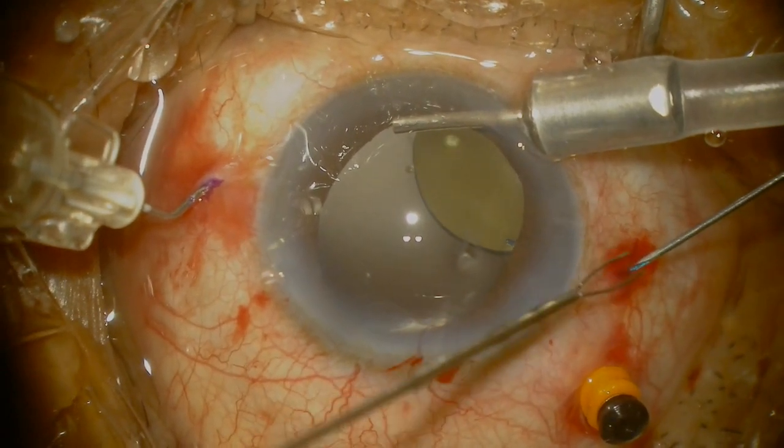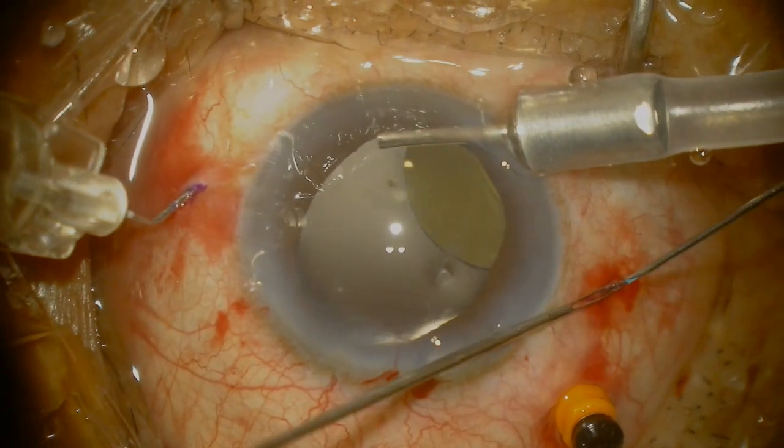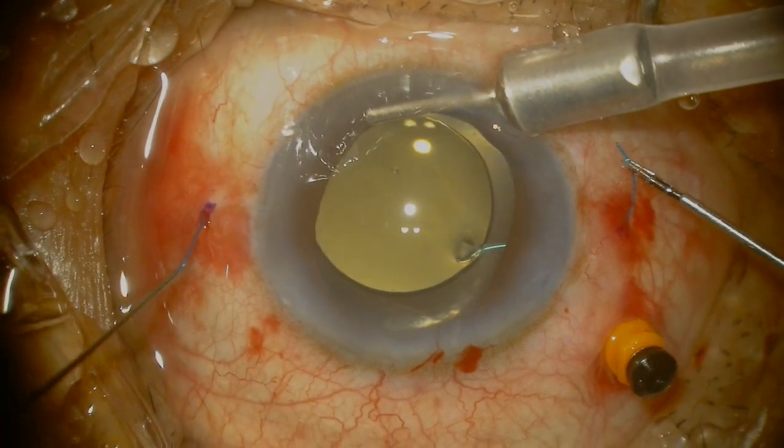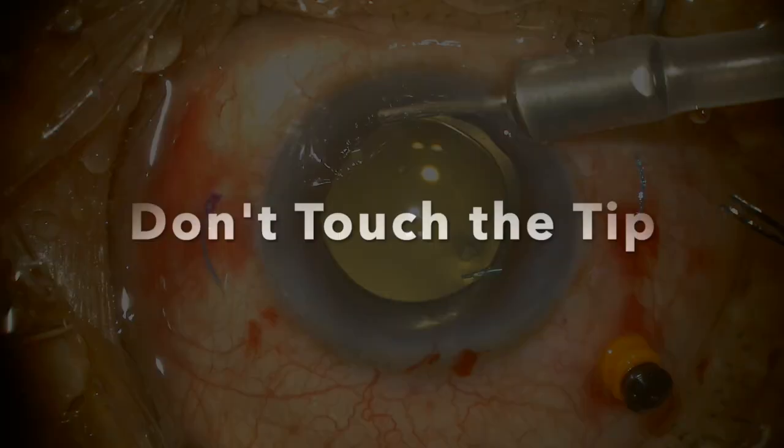I don't usually pull the haptics out at the same time. I know that's the traditional or conventional method that's been described, but I tend to pull them out one at a time, ensuring that I can grab onto the haptic so I don't pull the other end back in.